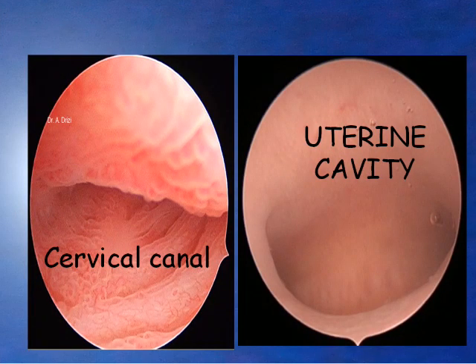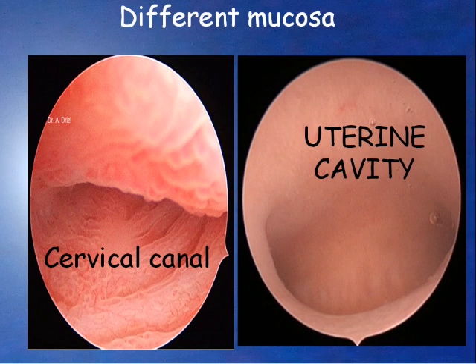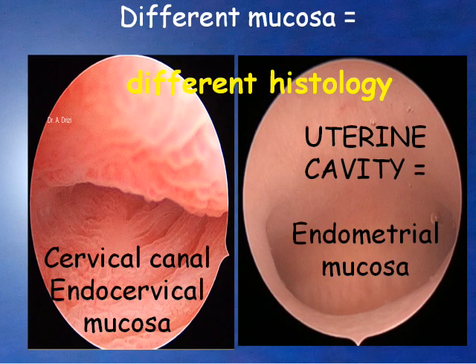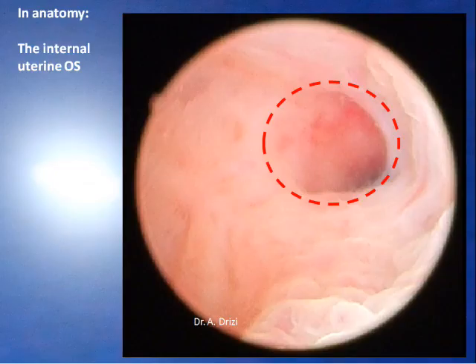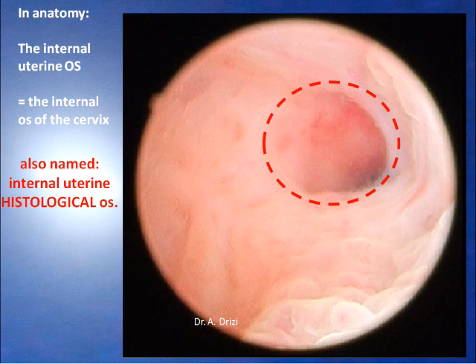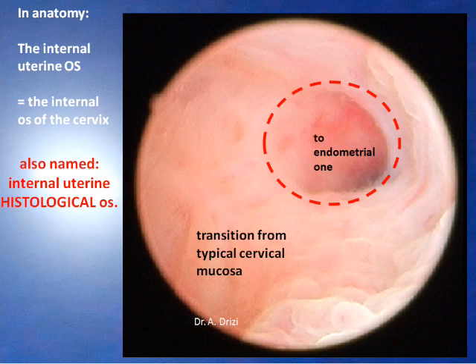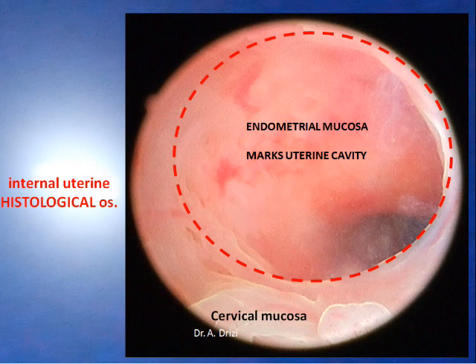The cervical canal and uterine cavity are aligned with different mucosa: endocervical mucosa for the cervix and an endometrial one for the uterine cavity — different mucosa, different histology. The internal uterine ostium, or internal ostium of the cervix, is also termed the internal uterine histological ostium, because it marks the transition from typical cervical mucosa to endometrial mucosa, which marks the uterine cavity.